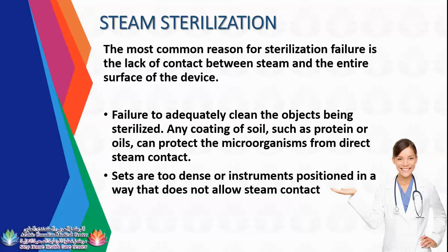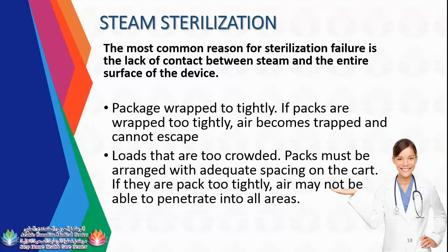The most common reason is packages wrapped too tightly. If packs are wrapped too tightly, air becomes trapped and cannot escape. So if air cannot escape, then wet packs will result. Sometimes it cannot evacuate enough steam, and then it can create puddles of water.